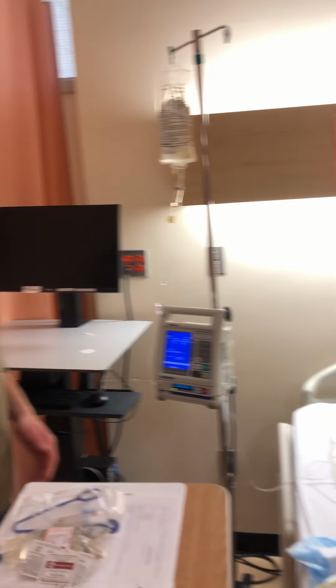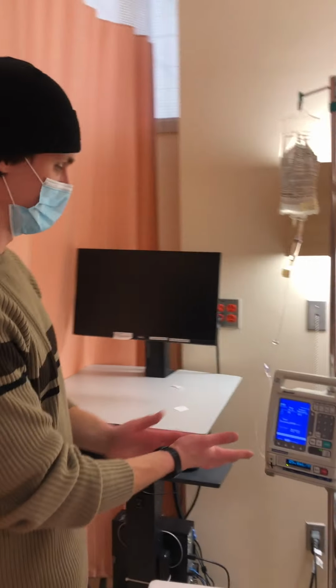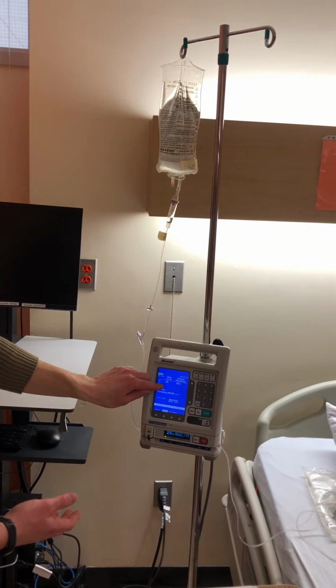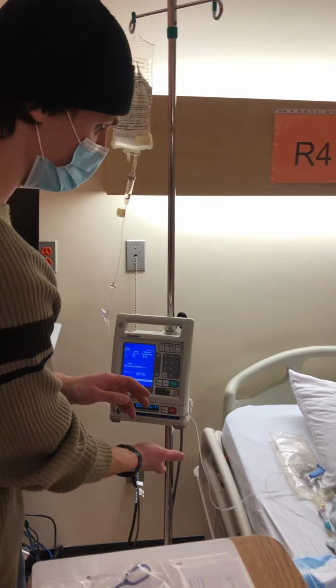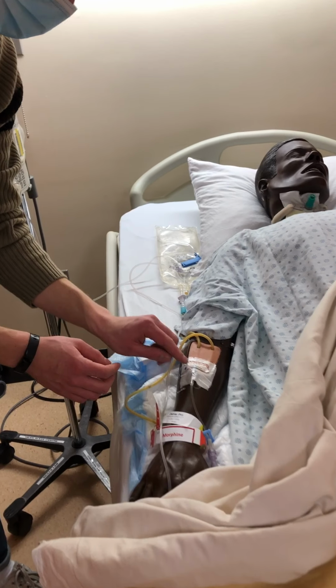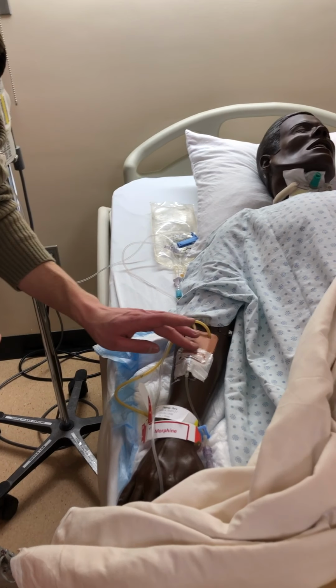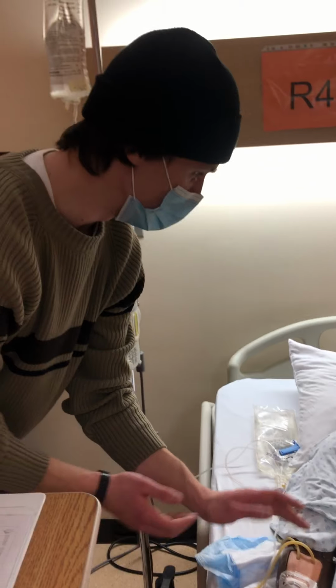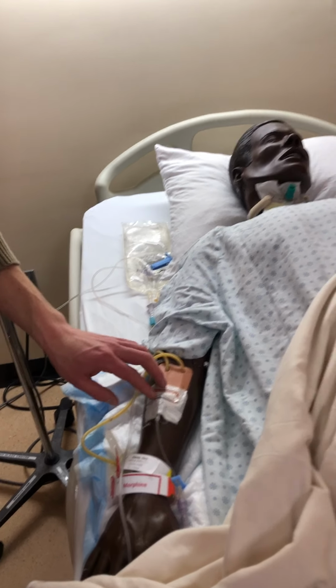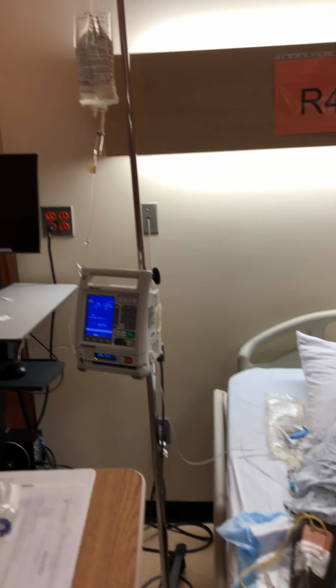So now I'm just going to assess the primary infusion here. I see that it's running perfectly. It's set at the rate that's listed on the MAR. There's no occlusions. Everything looks good here. There's no signs of phlebitis or inflammation here. Ask if they have any pain, and they say no, there's no pain, and it's not occluded, it's patent, so I can continue to use this IV site. So now I can proceed.